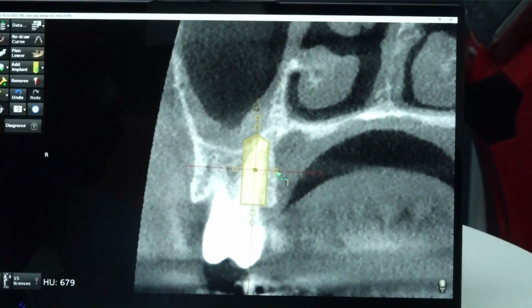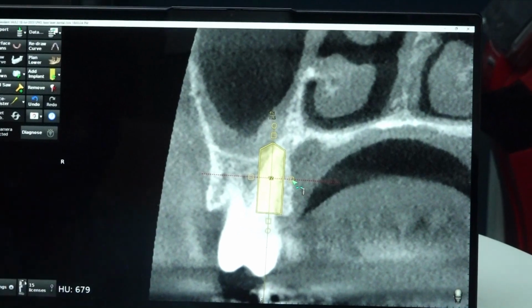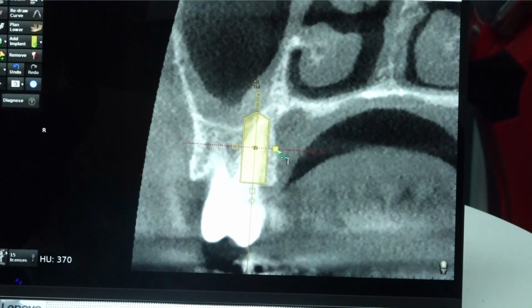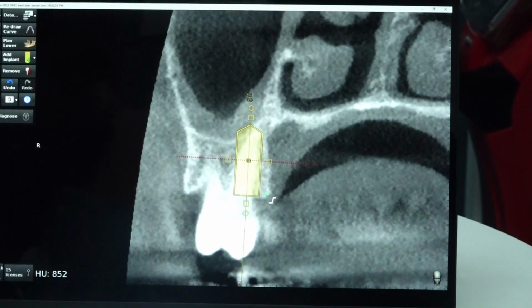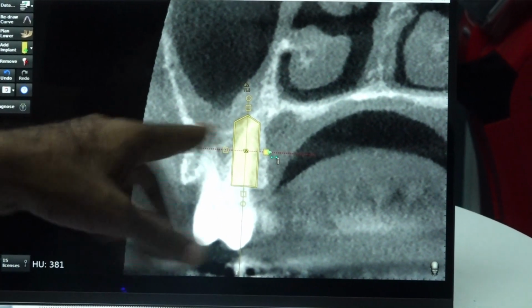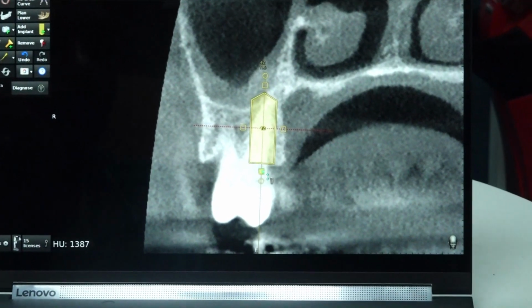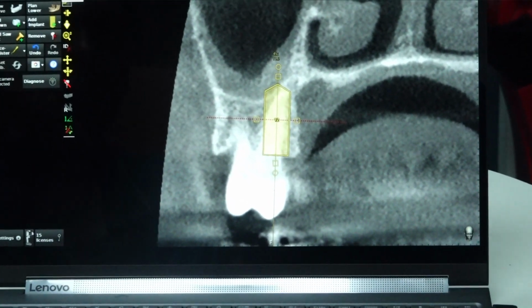Even in the post follow-up X-rays, no? Wherever we placed a wide diameter in a palatal socket, they integrated nicely. Initially I was having some doubt, but now it works well. So if the socket wall is well and healthy, there is no periodontitis, there is no bone loss, go for a wide diameter compressive. Not 4.2. 4.2 won't get good stability here. 5.5 will be better, or 5.5 basal. 5.5 basal, 12 mm. Okay, 12 or 10 mm with basal design.